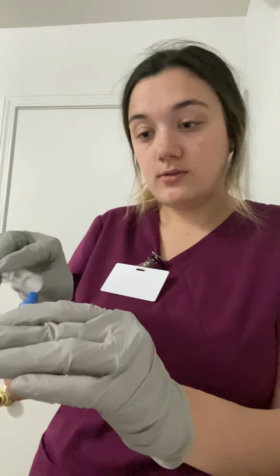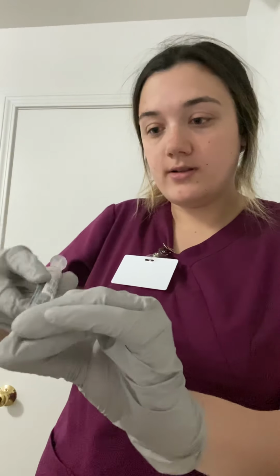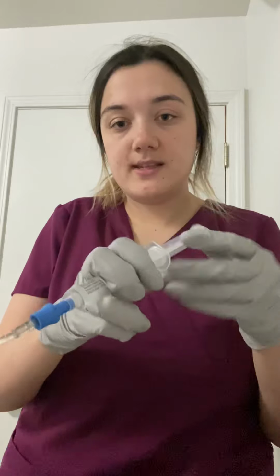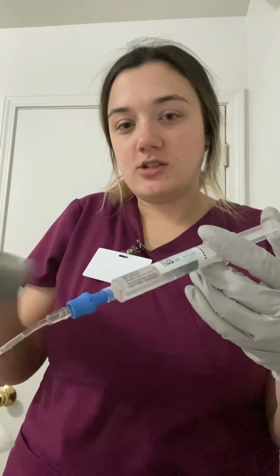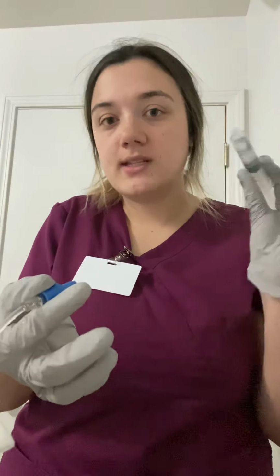And then we are going to unclamp this IV, this port right here. And then we're just going to connect to the port. I'm checking for patency of this IV. I just have it in a little bowl right here, but I'm checking to make sure. So I'm just going to push about 3 to 5 mils. It looks good, looks patent, no phlebitis, no infiltration that I'm seeing. If there was, I would obviously not infuse any medication, and I would notify the provider. I would remove the IV and such.